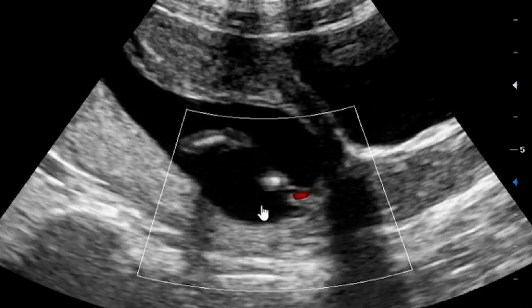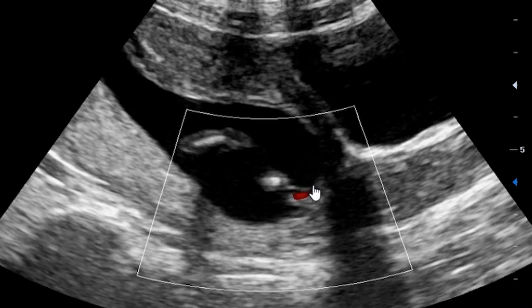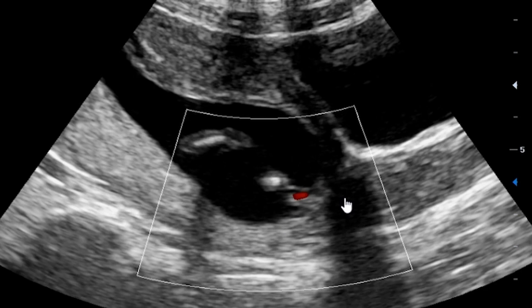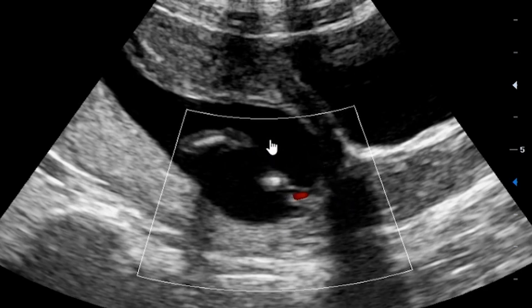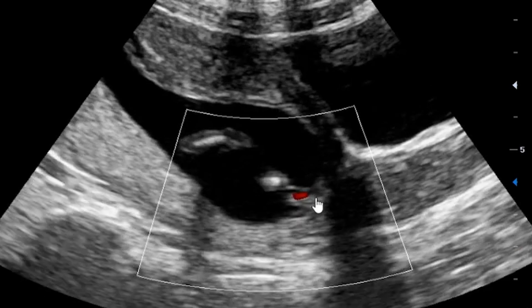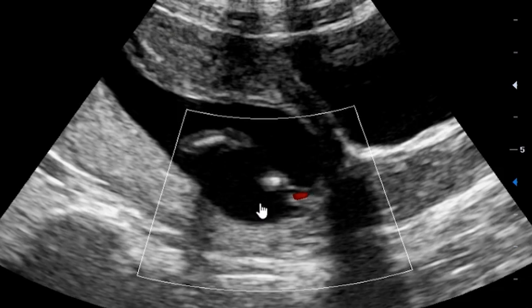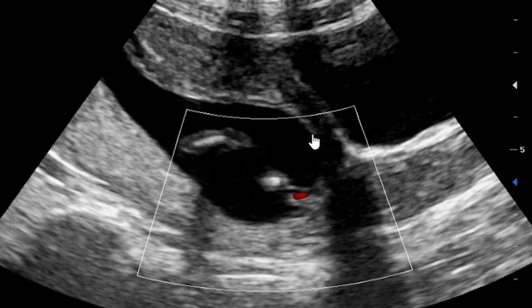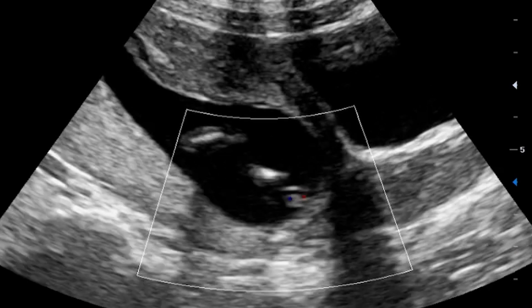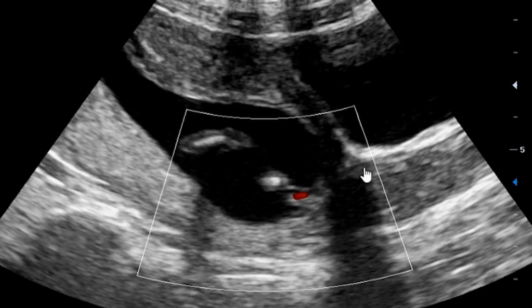If you see blood vessels adjacent to, just above, or seated on the os — and at times penetrating into the cervical canal — you are dealing with a case of vasa previa. We don't want to see blood vessels in this region. If it is the placenta seated here, we call that placenta previa; but if they are blood vessels, we call it vasa previa.